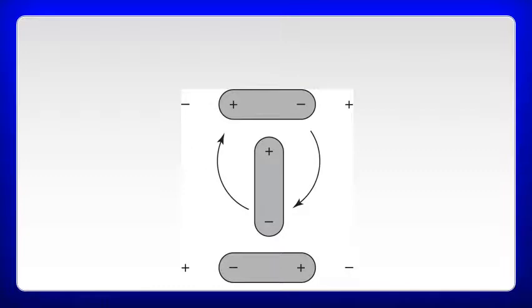And this is basically what's showing. The mechanical effect that occurs here is a shift in what are called the dipoles. And this creates that mechanical effect where, if the intensity is high enough, you'll generate heat, or you will just enhance the cellular processes that are going on with inflammation and healing. So you basically get this rotational pole movement that happens as the electromagnetic energy is passing through the body.